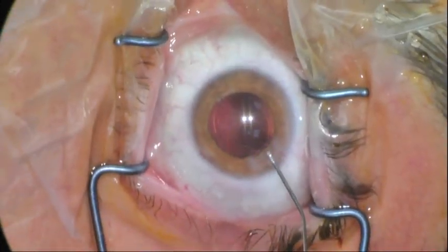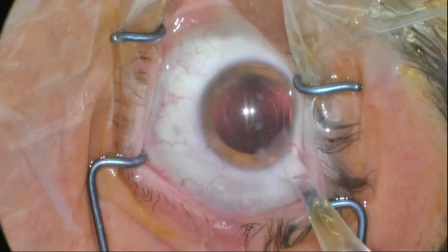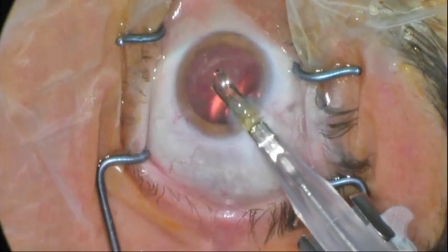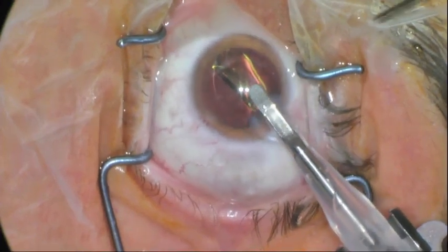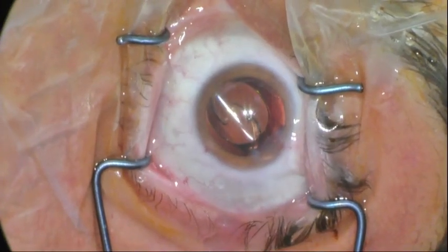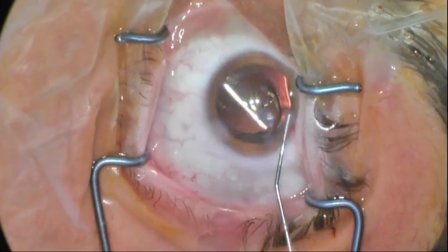So I hope that this has been useful to you. Feel free to join me on the web at www.supericure.com. In this case, we'll just continue with the lens insertion, which unfolds nicely. And then we proceed with removal of the viscoelastic material and testing of the wounds. I prefer in cases where there is any potential weakness of the posterior capsule to hydrate before I remove viscoelastic — it stabilizes my chamber.